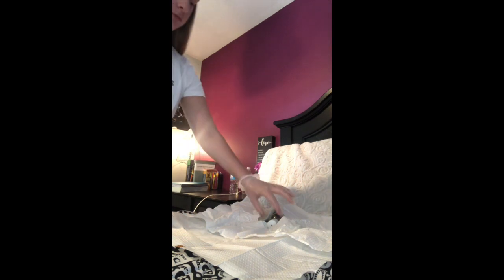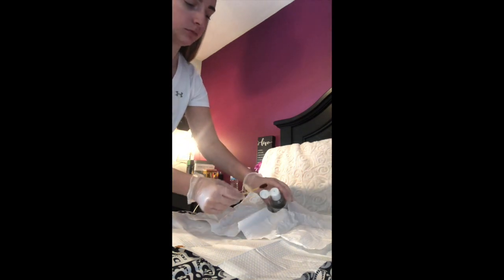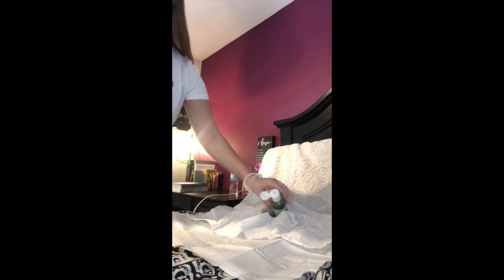Next, I'm going to insert the catheter and explain to the patient that they may feel discomfort while the catheter is being inserted. I'm going to encourage them to relax, take deep breaths, and I'm just going to let them know that it'll be over before they know it. So for a male, I want to advance the catheter about 17 to 22.5 centimeters or until urine flows out of the end of the catheter.